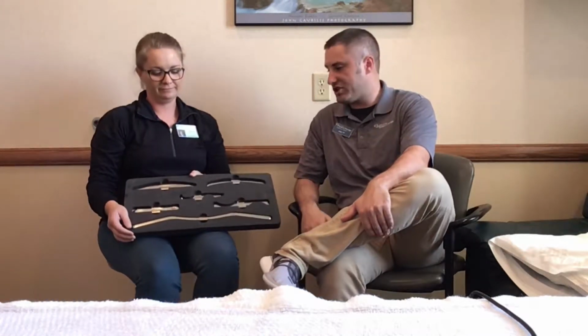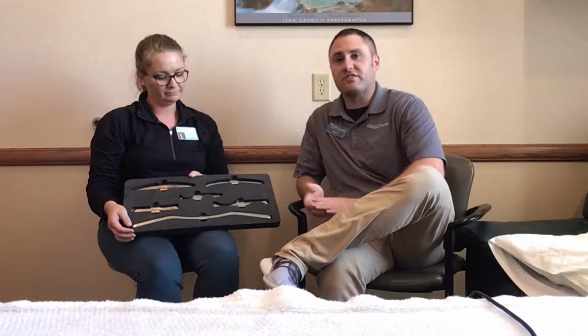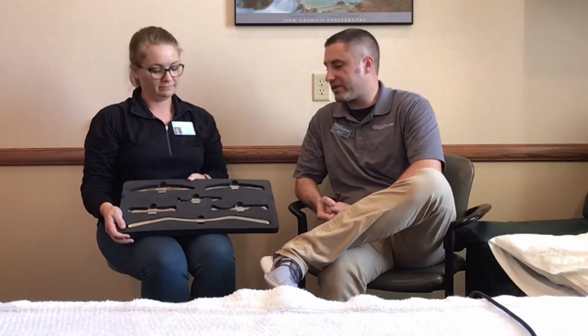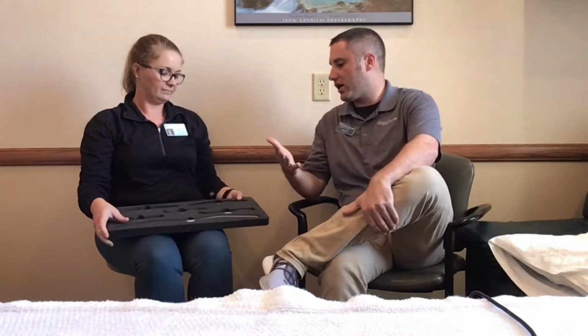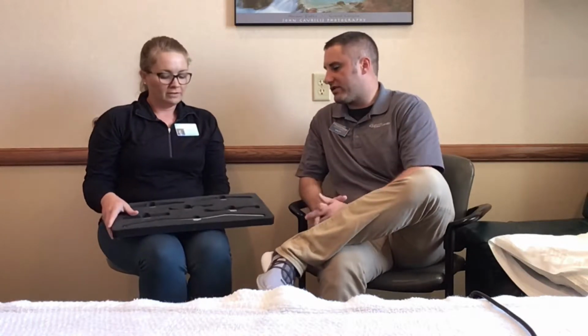And today we're going to talk about a manual therapy technique called Graston, which is part of what we call instrument-assisted soft tissue mobilization. We use these tools here, and Jenny's going to demonstrate them later on patients. So Jenny, tell me what's the theory behind using a device like this?